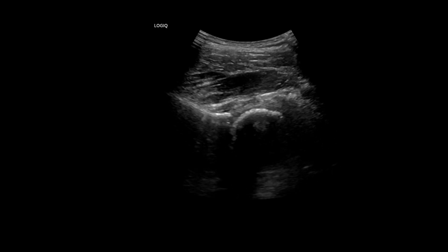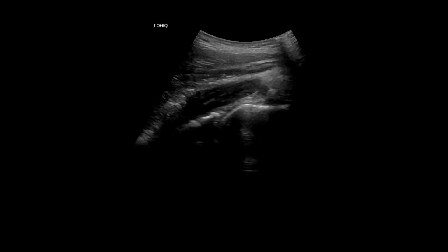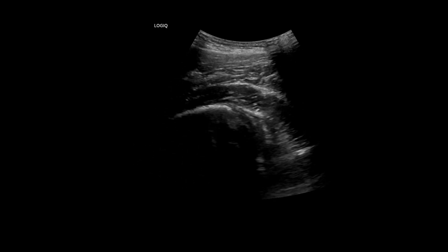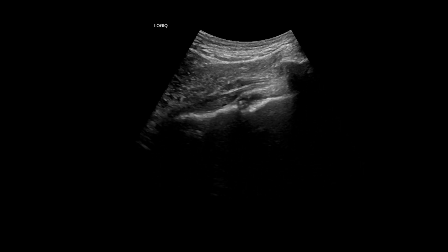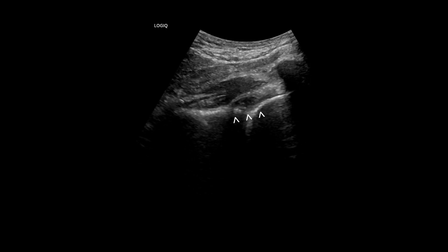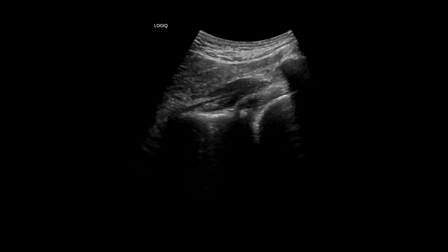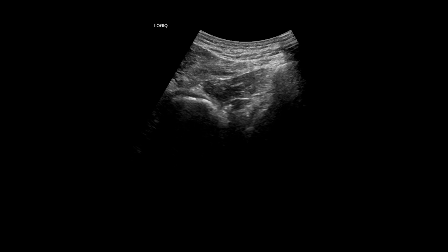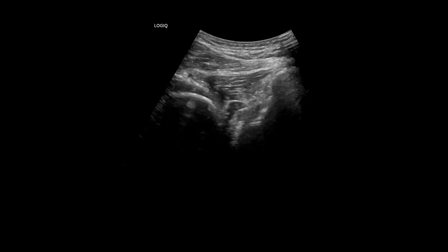I then moved to the upper lateral aspect of the joint, beneath the gluteus medius, using the convex probe. No specific pathology was observed on the superficial surface of the joint capsule. As I continued to scan over the posterior capsule, the posterior transverse view revealed fluid outpouching into the posterior synovial recess, indicating posterior extension of the joint effusion. In this transverse view, the ischial bone appears on the left side of the screen, the greater trochanter's posterior aspect on the right, and the quadratus femoris muscle lies deep to this.